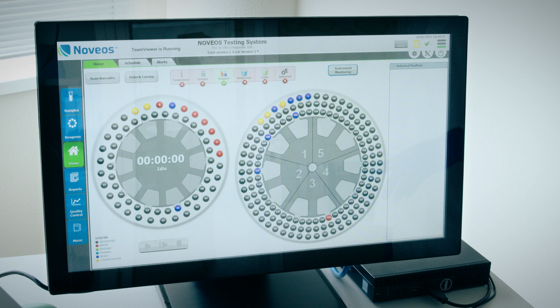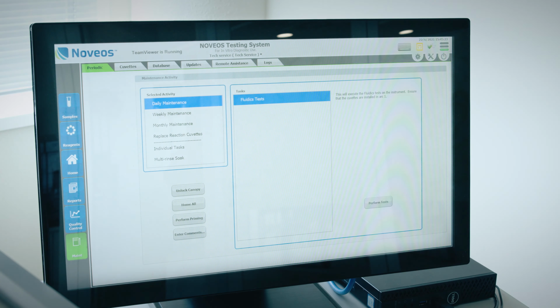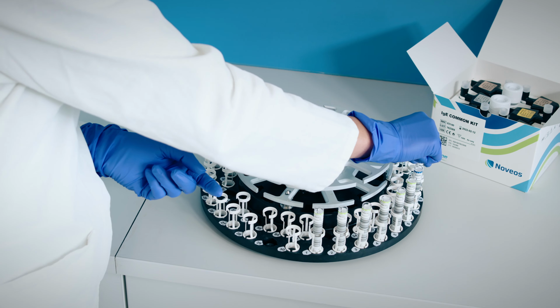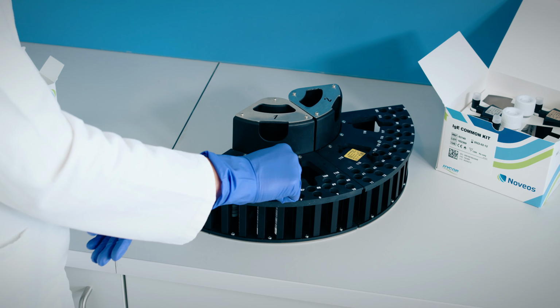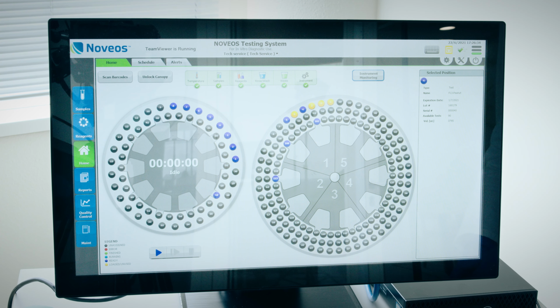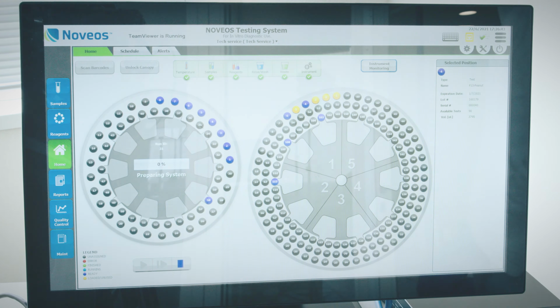Starting an assay. Check the instrument monitoring system, and if necessary, refill the system fluids or empty waste. Perform daily maintenance. Load the sample rotor. Load the reagent rotor. Vortex the beads. Scan barcodes and missing reagents if necessary. Check the status and warning bars. When everything is green, you may start the assay.